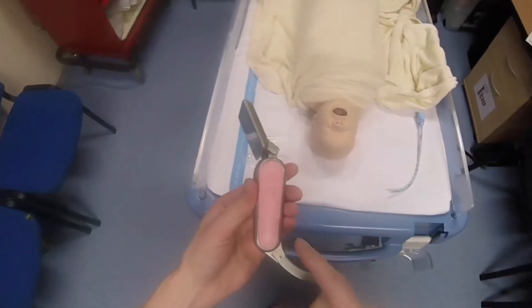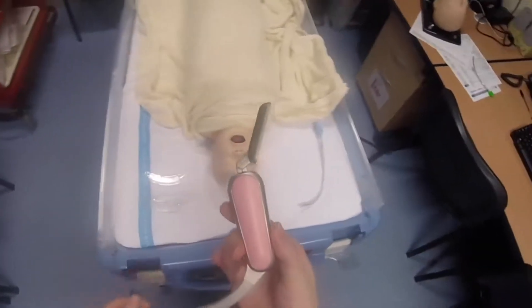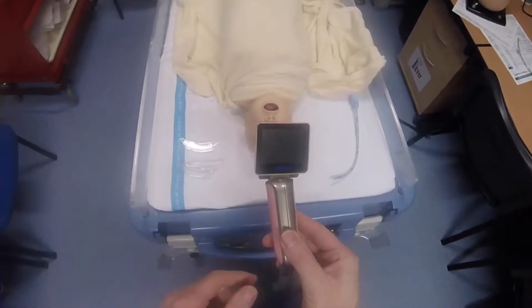Today I want to give a quick demonstration of the paediatric Medan video laryngoscope by Supporting Healthcare. This laryngoscope comes in two versions: a paediatric version and an adult version.